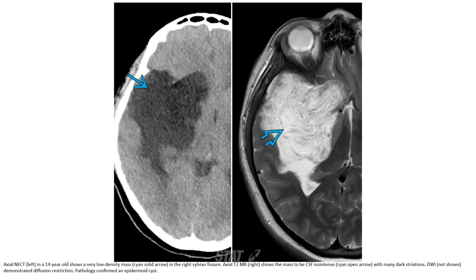This is a non-enhanced CT on the left image of a 14-year-old, showing a very low density mass in the right sylvian fissure. On the right is a T2 image showing a mass iso-intense to CSF with many dark striations. DWI demonstrates diffusion restriction, pathologically confirmed as epidermoid.